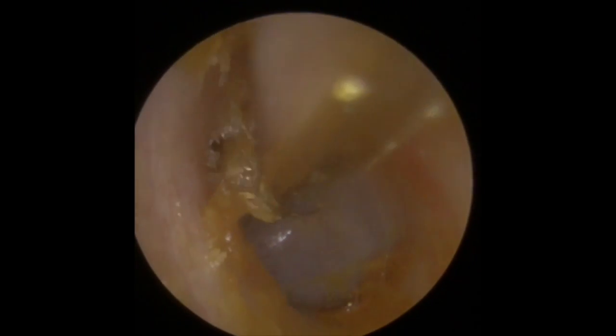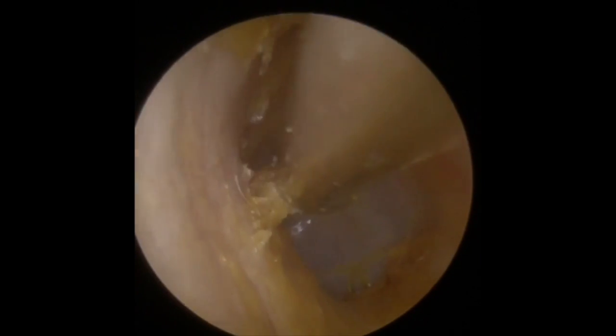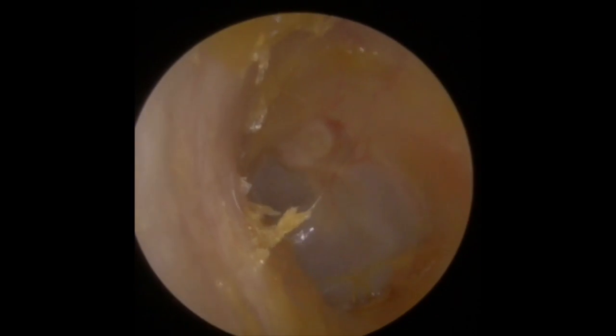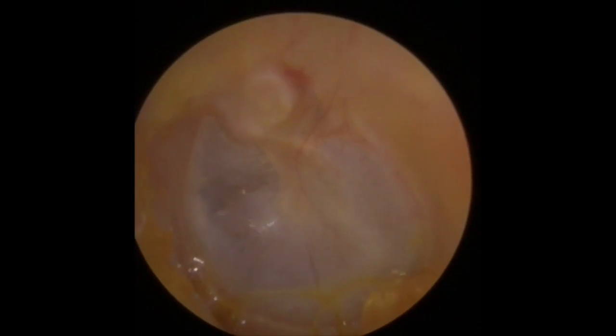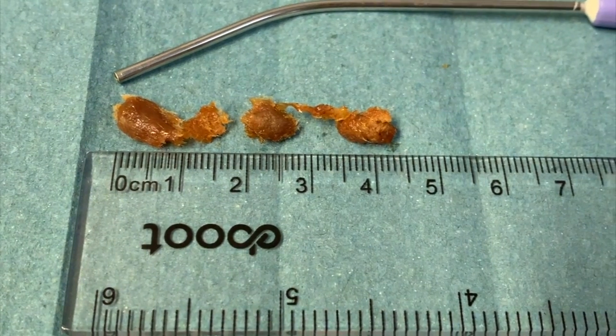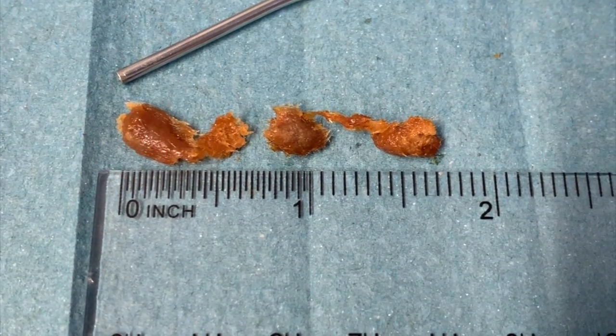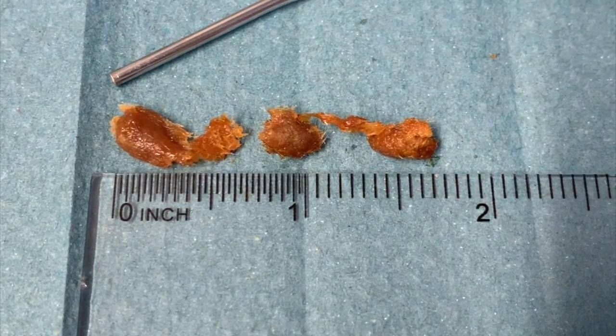Just peel that down to get rid of that. There's the eardrum. So this is what we removed — all from one ear. You can see it was quite a substantial piece of wax altogether, just over an inch and a half.